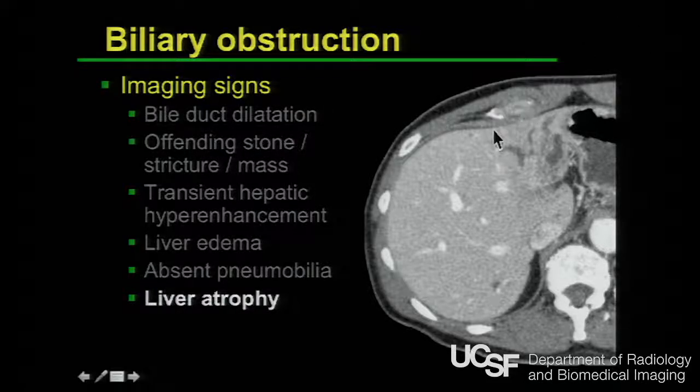And it's very common to actually see incidental left lateral segment atrophy of the liver. And when we see that, we look for the dilated ducts, and we know that was a chronic obstructing process. These patients may require ERCP for brushings because there may be something obstructing, either a stone or other process, but it actually seems to occur more often in the left lateral segment. Liver atrophy obviously is a later finding for duct obstruction.